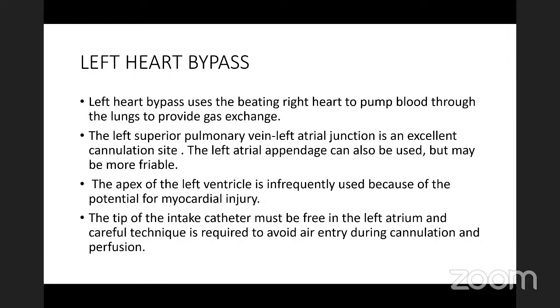The apex of the left ventricle is infrequently used because of the potential for myocardial injury. The tip of the intake catheter must be free in the left atrium, and careful technique is required to avoid air entry during the cannulation or perfusion.